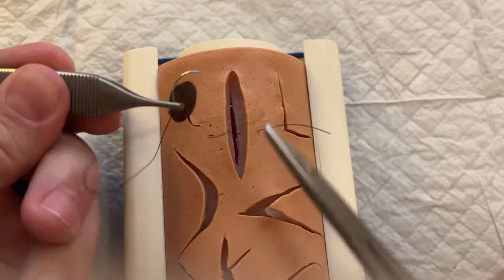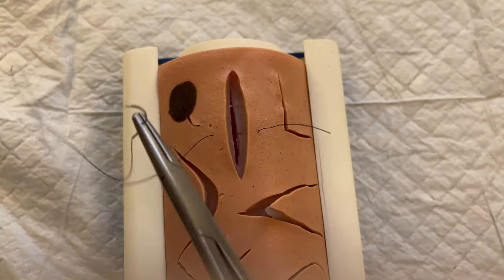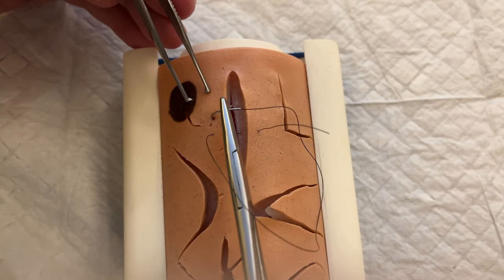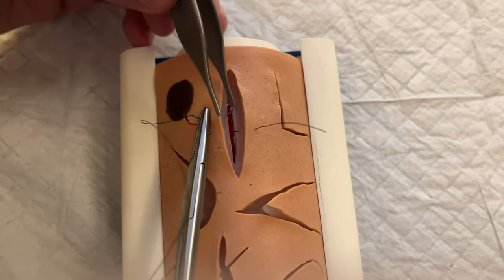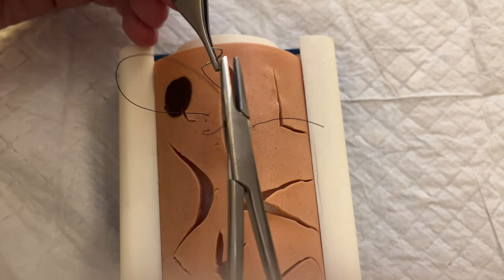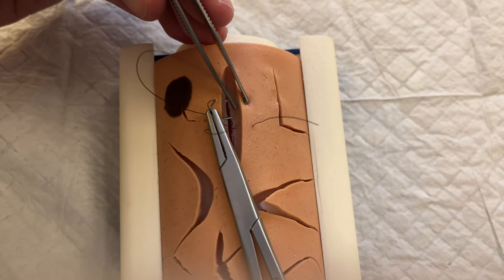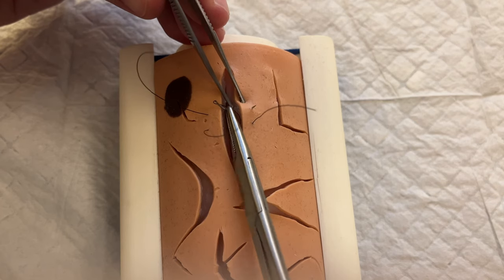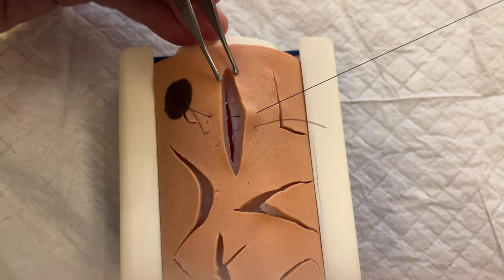With a horizontal mattress suture, we reset our needle in a backhand method so that we can go back the other direction, doing the same thing just a little further down the laceration. We make sure we are entering the subcutaneous tissue on the other side at the same depth, and we exit the skin in line with our first pass.